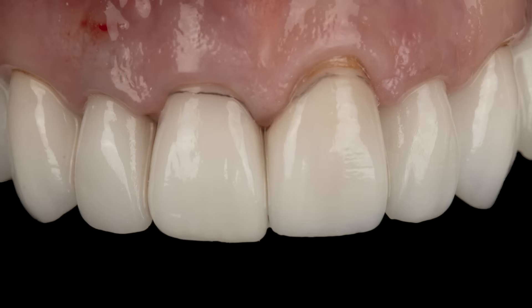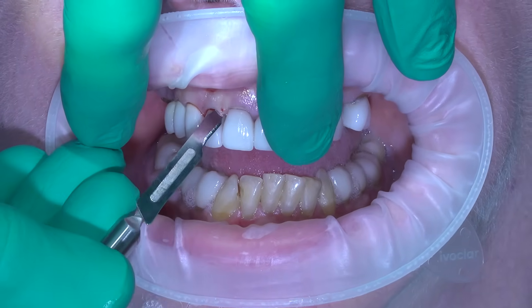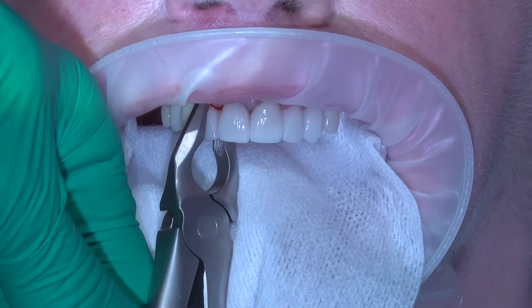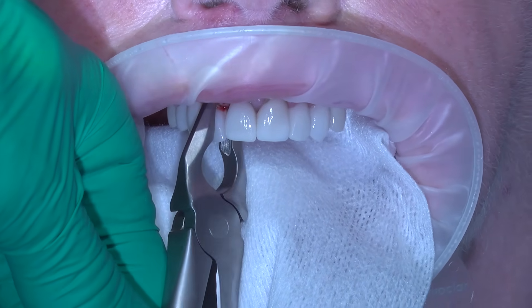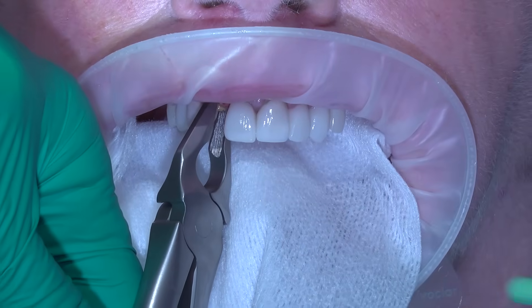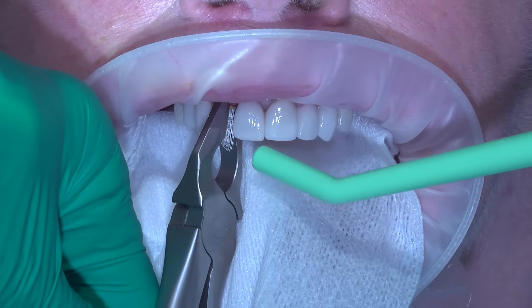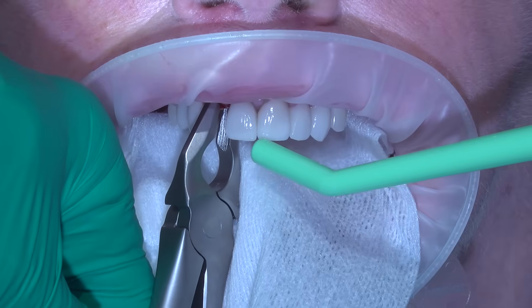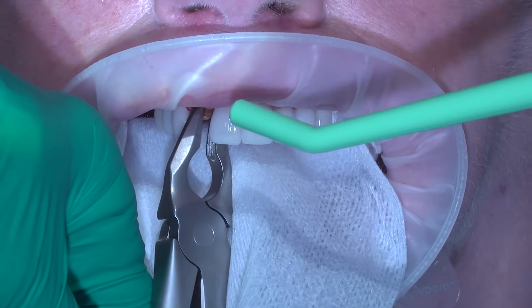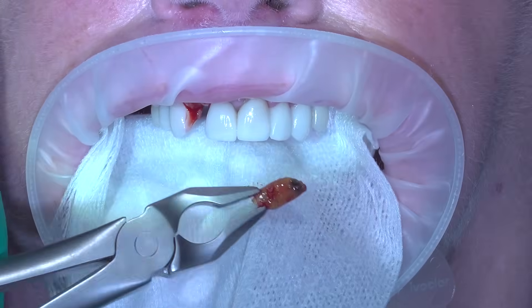What we have here is a failing tooth number 7 in the lateral position. The patient's been anesthetized. We use a 15 blade to come in and do an inter-sulcular incision. We don't elevate the tissue at all. I'm going to apply rotational forces with my forceps — rotational forces on a single-root tooth — and the crown separates first, which is what you would expect from a failing tooth. We go down right into the sulcus where we made that initial incision and grab onto that little bit of tooth structure left with rotational forces, which will protect the thin buccal plate. And out comes the root tip. So we've got the failing tooth out in just a couple of moments.